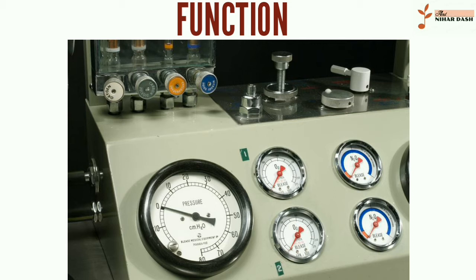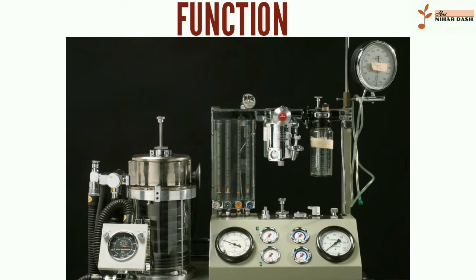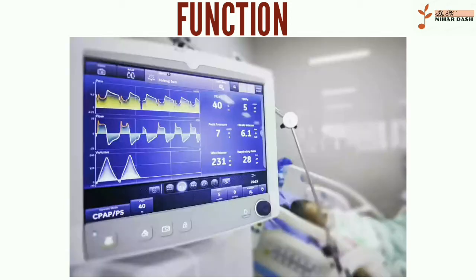Ventilators may also be equipped with monitoring and alarm systems for patient-related parameters, e.g., pressure, volume, and flow, and ventilator function, e.g., air leakage, power failure, mechanical failure, backup batteries, oxygen tanks, and remote control. The pneumatic system is nowadays often replaced by a computer-controlled turbopump. Modern ventilators are electronically controlled by a small embedded system to allow exact adaptation of pressure and flow characteristics to an individual patient's needs. Fine-tuned ventilator settings also serve to make ventilation more tolerable and comfortable for the patient.